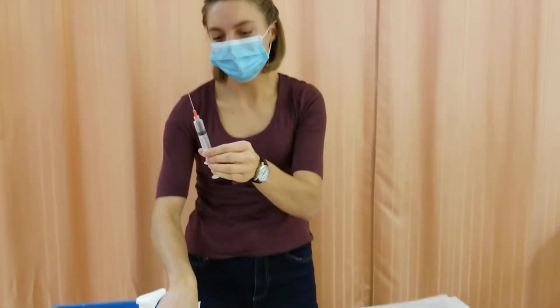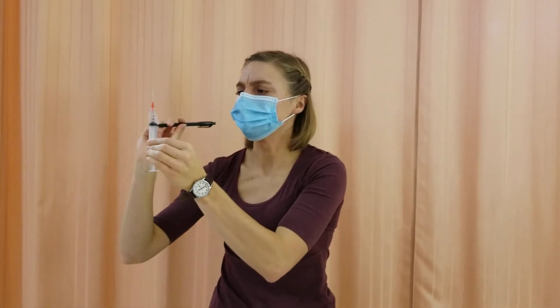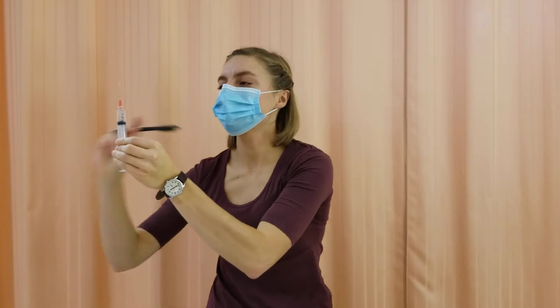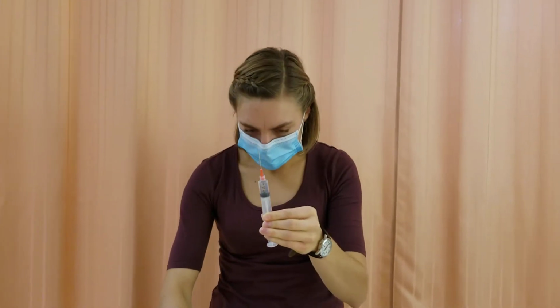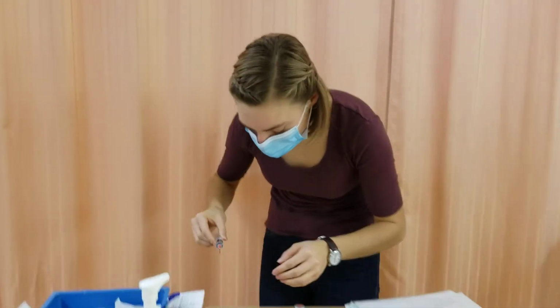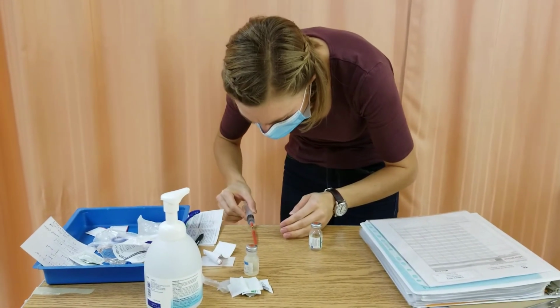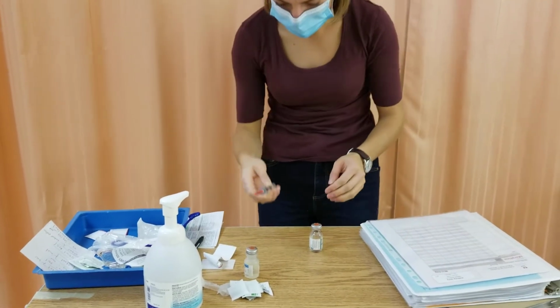Getting out any air bubbles. Over the med waste. And then here I would have 4 mils. Oh, sorry, that's not my tubing. I'll be labeling my tubing when it's up.